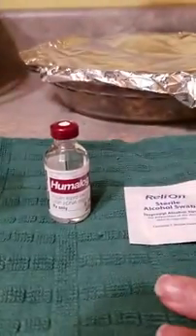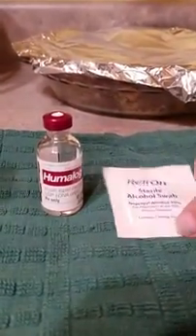So happy Thanksgiving. I need insulin, I need an alcohol wipe, and I need a cartridge. Or an alcohol swab, or whatever you guys call it.